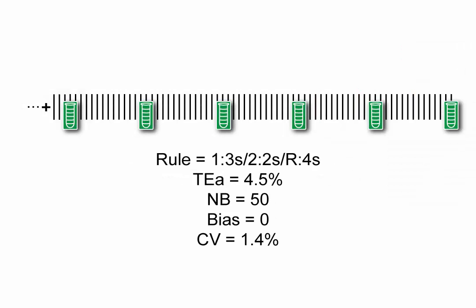The number of unreliable correctable results depends on the QC strategy, test method performance relative to the allowable total error specification, TEA, and the size of the out-of-control condition. The QC strategy is the QC rule, number of QCs evaluated, and number of analyte examinations between QCs, NB. Test method performance is the test method's bias and imprecision.